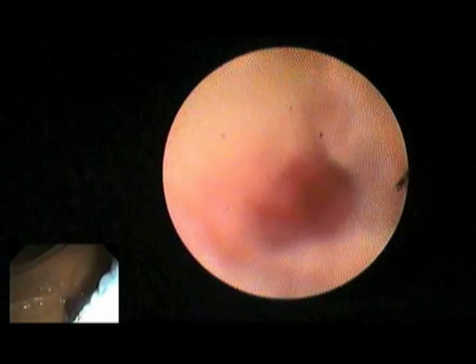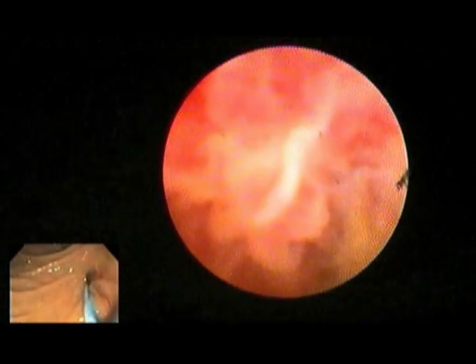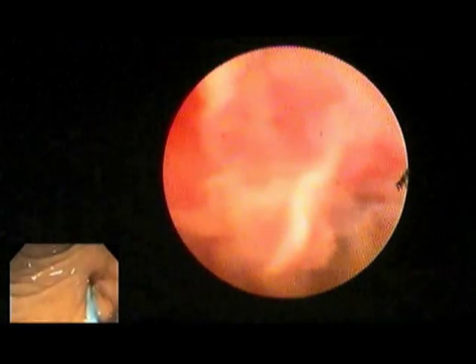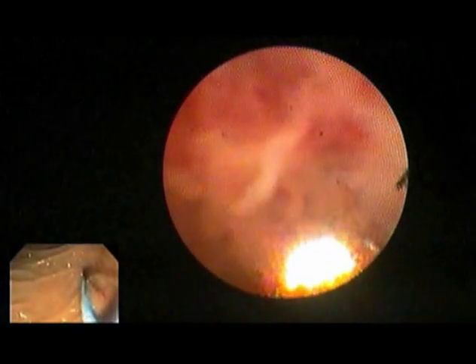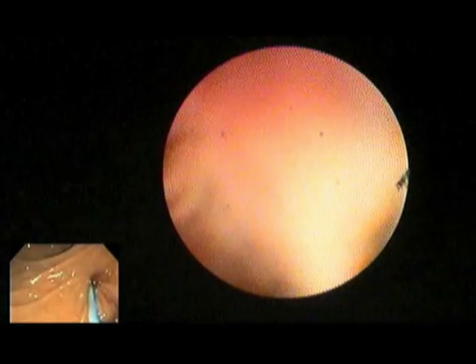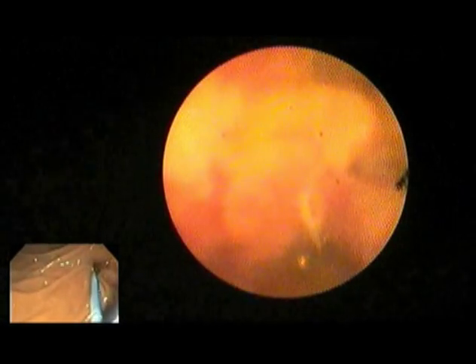However, as you will see in this case, when we talk about strictures cholangiographically, there are fibrotic aspects to the stricture and the malignant aspects to the stricture. And the idea that this tumor could have penetrated the mucosa in one area. And as we pull back, you'll start to see this area, which is much more villous and frond-like. And this is really what we want to see. And this really is an area to target for our SPY forceps.